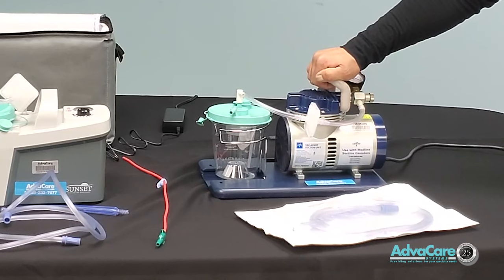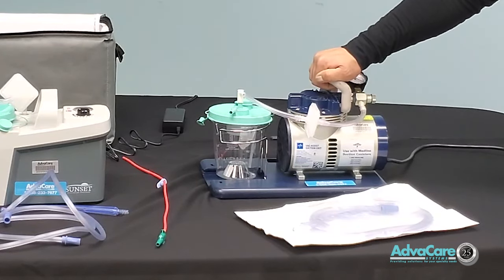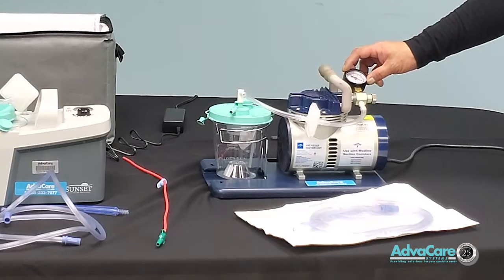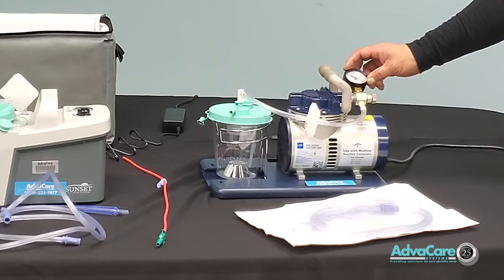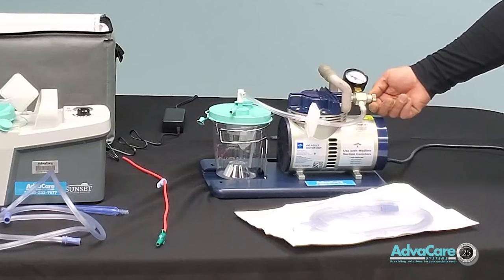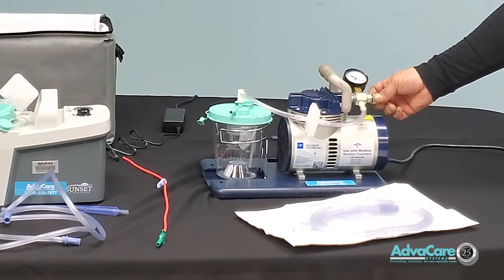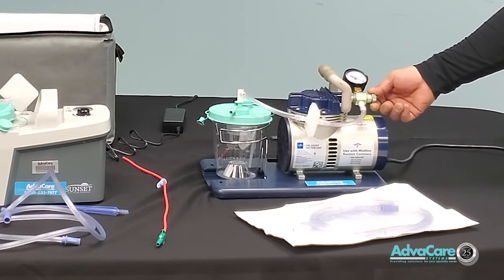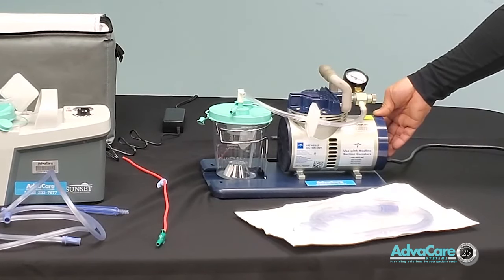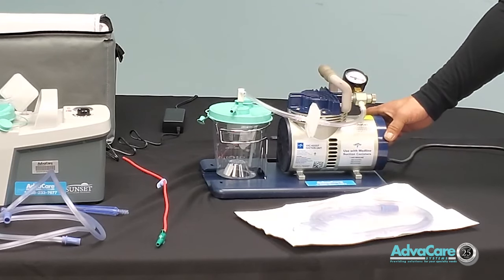Every machine will be equipped with some type of handle so you can carry and place it. You have an air pressure gauge or dial gauge that allows you to set the vacuum pressure in millimeters of mercury. You also have a pressure control dial that will allow you to increase or decrease your suction vacuum pressure.